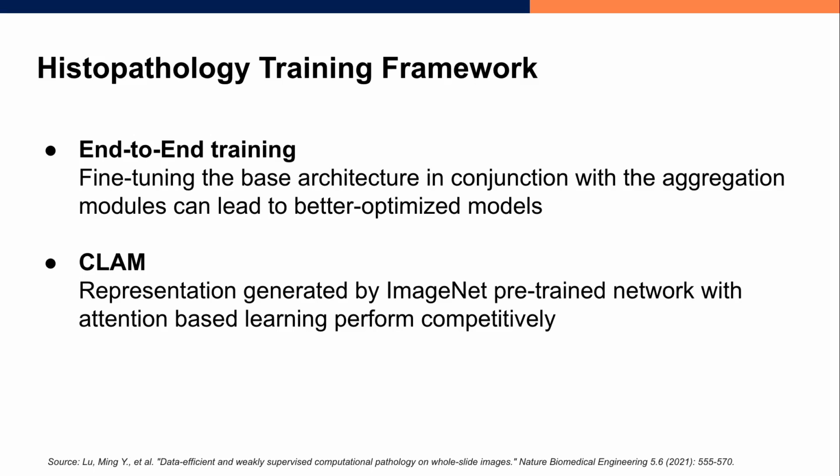Quickly, before moving to our experiment design and takeaways, here we highlight some of the notable references that inspired our work. We divide these reviews into three categories: histopathology training framework, transfer learning, and histopathology pre-trained encoder. In histopathology training framework, oftentimes to train the first stage of the previously explained model, due to lack of patch-level annotation, assumptions are made like all the patches coming from an unhealthy patient contain disease.